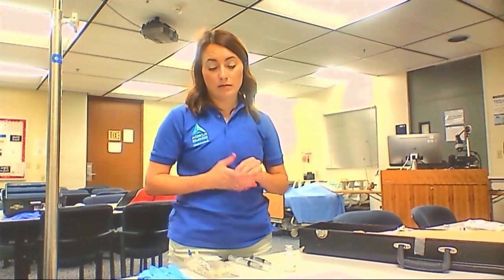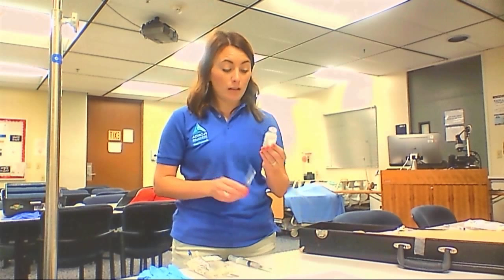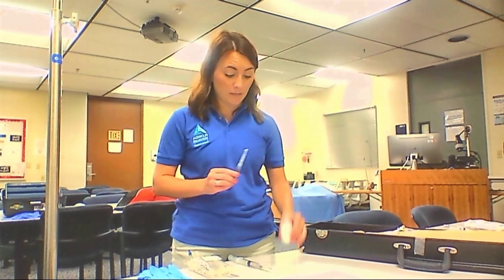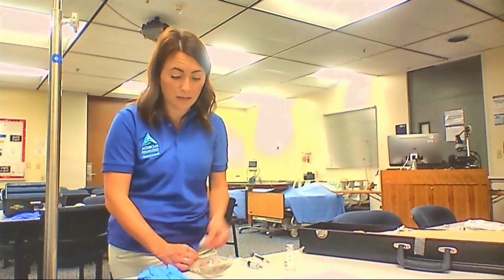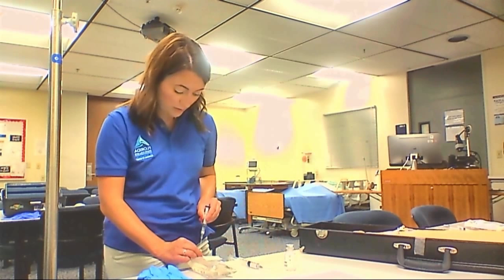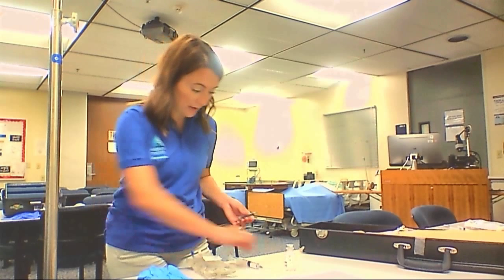So now I can begin doing my IV. The doctor has ordered vancomycin, so I have my vancomycin pulled up, and I want to check to make sure that the expiration date is correct and that I'm giving vancomycin, which it is. The next thing I want to do is clean the port where the vancomycin is going to be inserted to ensure minimal risk for spread of infection. Then I'm going to insert the vancomycin into the saline bag.